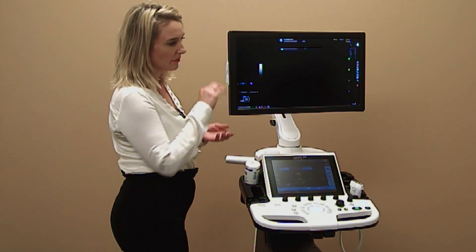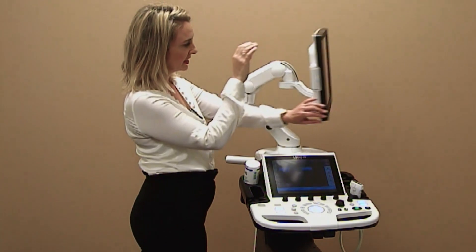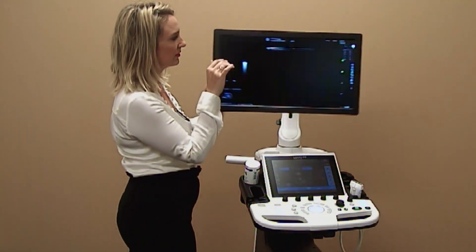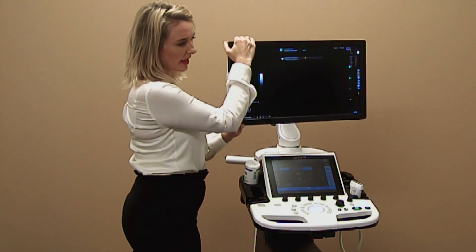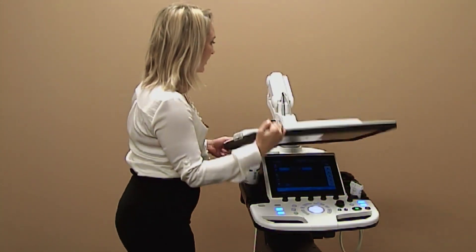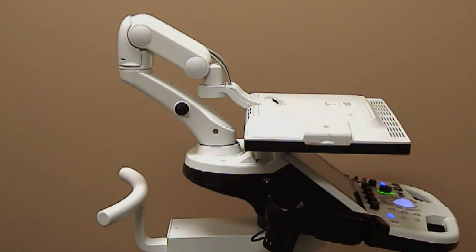The Logic P9 monitor comes on an articulating arm that can swivel from side to side, move down and up, and be pushed down for portability. For safe transport, simply lock the hook into the monitor by using the lever.